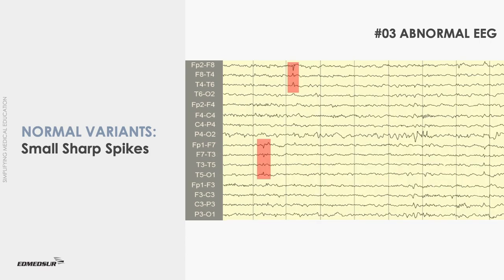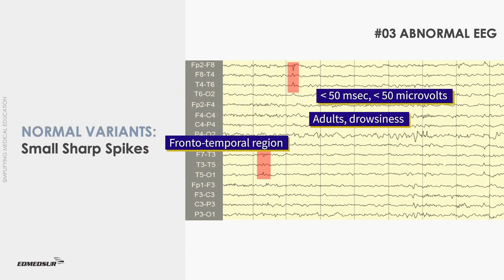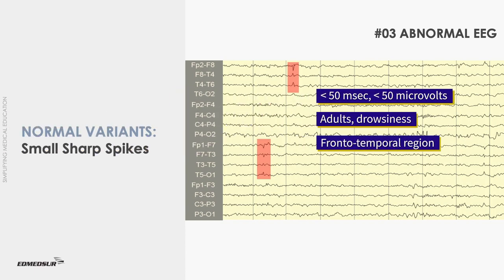Small sharp spikes of sleep, also known as benign epileptiform transients of sleep, are monophasic or diphasic spikes with steep ascending and descending limbs. They have short duration and low amplitude, with duration being less than 50 ms and amplitude less than 50 microvolts.